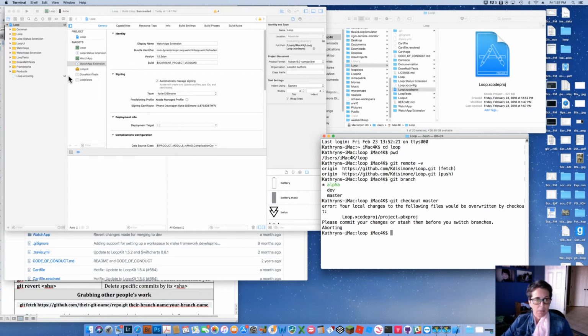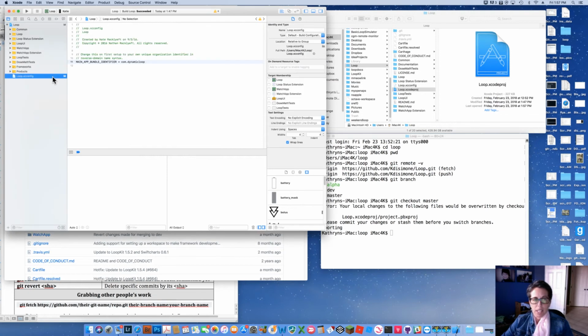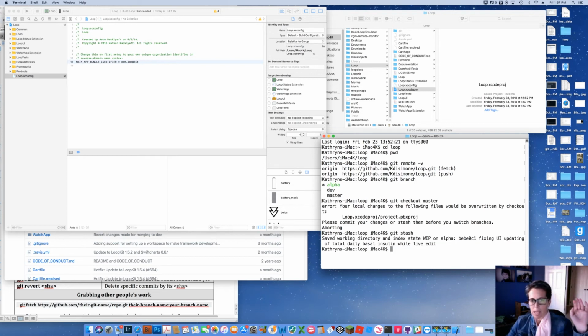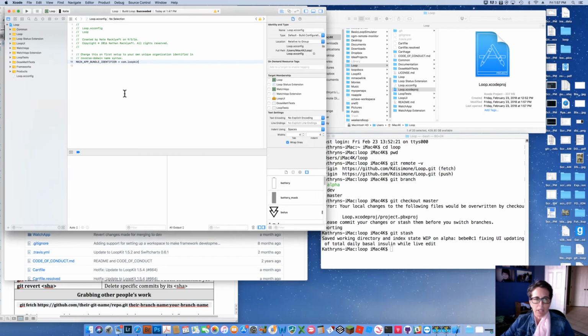And so these particular ones, I don't really want to save right now. I just want to get rid of them. And so what I can do is I can come here and say git stash, and that means get rid of them, stash them somewhere else, make them go away. And bam, look what happened. The M's went away, it went back to loopkit, it got rid of all of the modifications that I hadn't committed to memory. So if instead I had decided I wanted to save those changes, I would have done a commit message. So let's take a look at what that looks like.